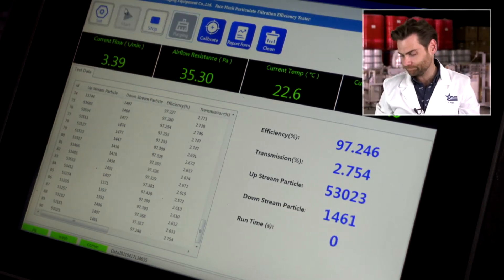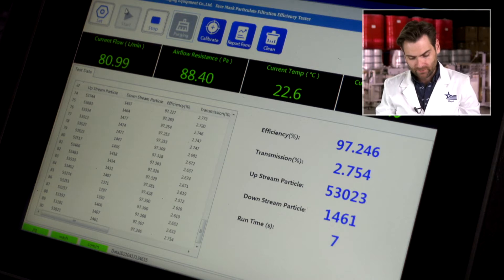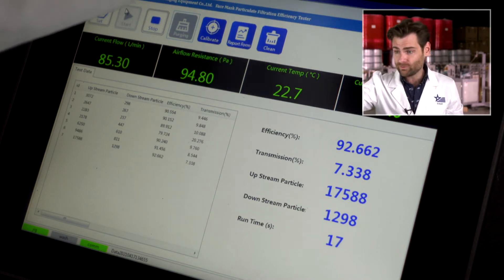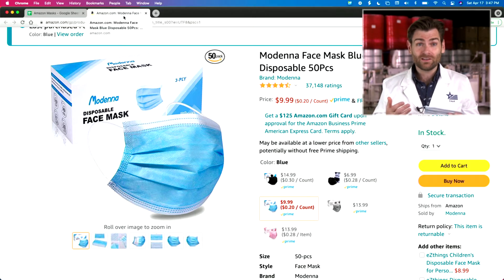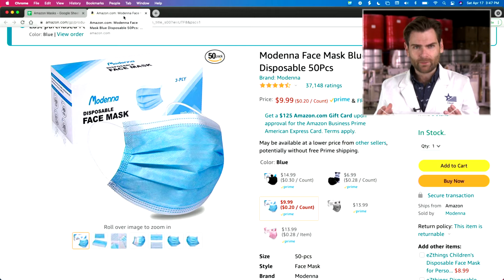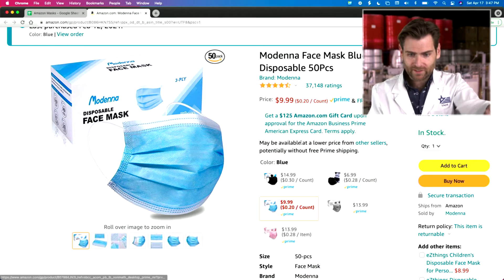All right, let it rip — now we're actually testing it. The airflow resistance is 95 to 96, which is pretty breathable. You want it to be under 150, and there's definitely a correlation between breathability and less filtration, so we'll see how well this does. I'm gonna give it four stars on construction — the first couple ear loops broke, but I don't think it's so loose that it won't fit on a normal-size face.